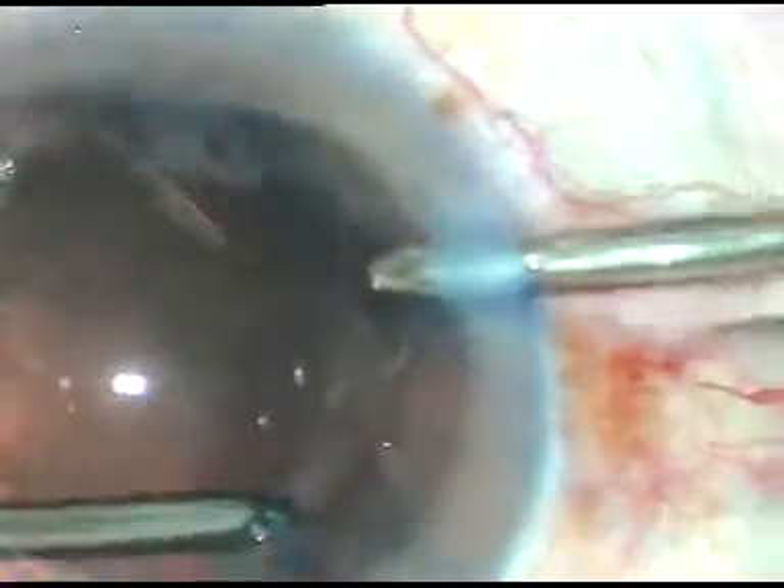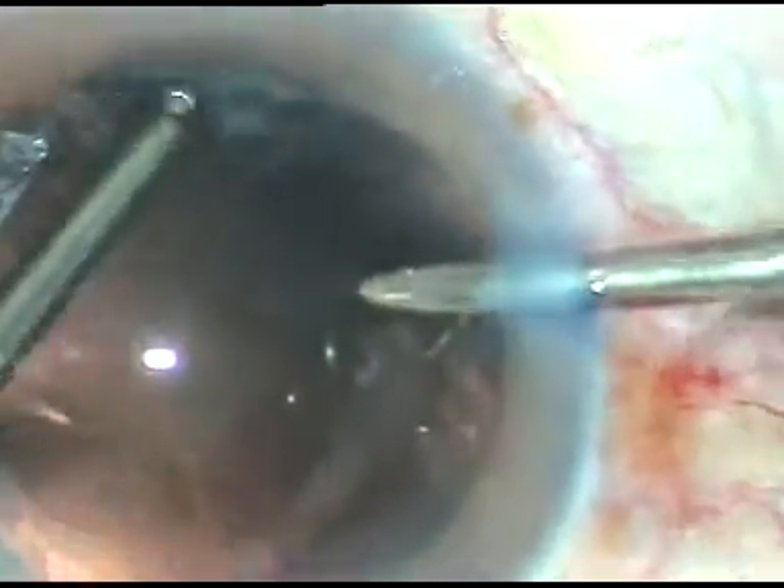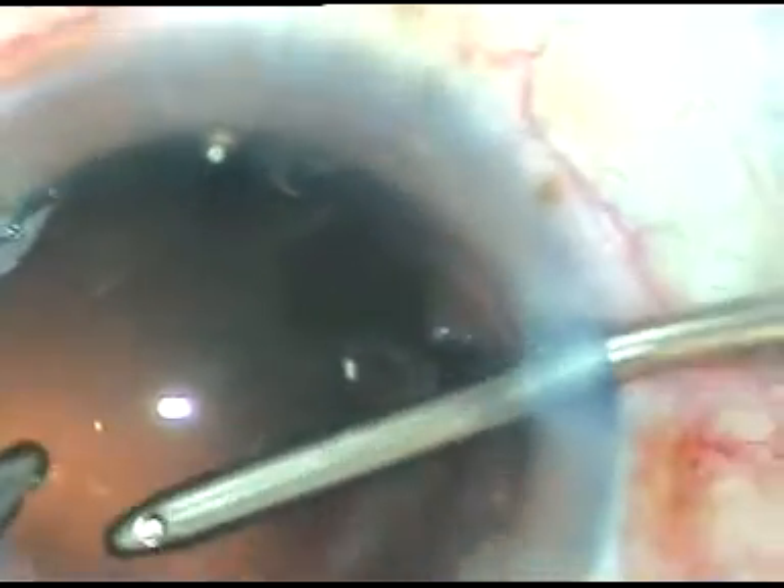So I am just irrigating over the cells sticking to the posterior capsule, and you can see the cells get dislodged. Once the cells are dislodged, they can be removed by bimanual IA or Simcoe cannula if you want. The cells are dislodged and the posterior capsule is nicely polished, then aspirated by bimanual irrigation-aspiration.